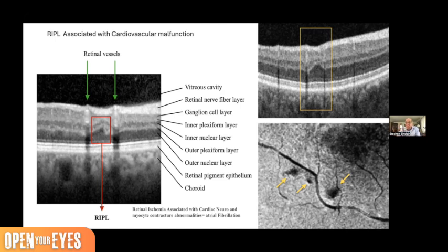Dr. Sinclair, when we see this, what do we tell the patient? I think that we're seeing some significant microvascular things, whether it's associated with their diabetes or whatever. So we've got to think about risk to your heart and the brain as well, with Alzheimer's and these other things. So you need interphysician referral and understanding across the board so that we can start to analyze this and treat them better systemically.